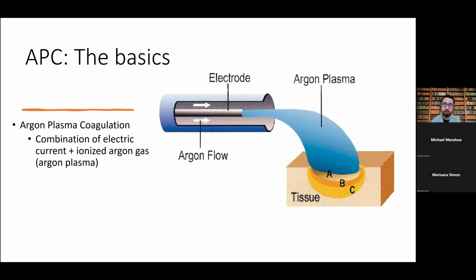So now this has become a non-contact mode. Otherwise, it's pretty much an equivalent of electrocautery. This is a non-contact form of tissue ablation. Why is it useful? Well, it's useful because one, you don't have to touch the tissue, and we'll see how that can be useful. And two, you can now take turns.